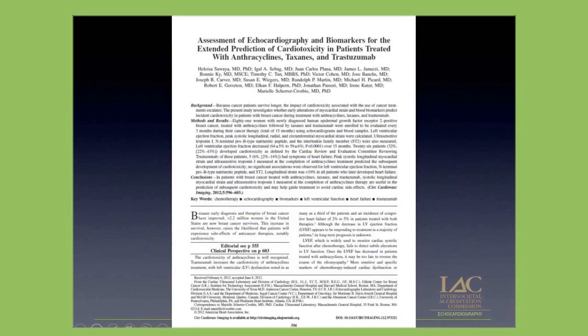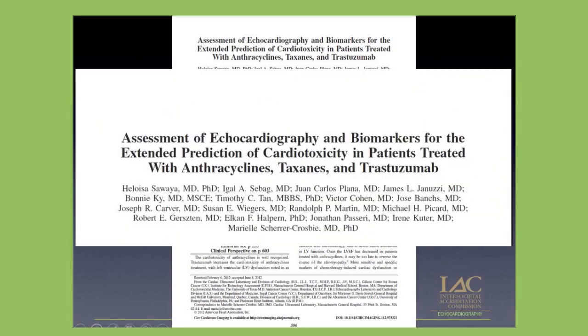So you're going to see right now two pieces of literature that use two different strategies. The first one is going to use an arbitrary cutoff. The second one is going to look for a percentage reduction. So let me share with you the first piece of literature. This is work that I had the pleasure of doing with Marielle Scherer-Crosby. By that time, she was at Mass General Hospital, also with collaboration from UPenn and from McGill. It was a beautiful experience.